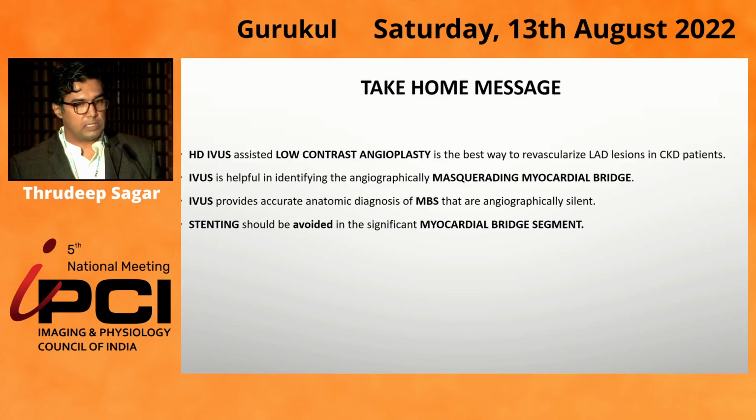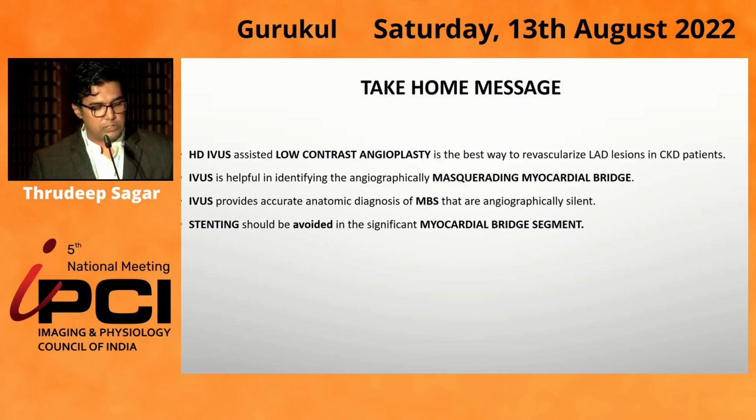My take-home message is that HD IVUS assisted low contrast angioplasty is the best way to revascularize LAD lesions in CKD patients. IVUS is helpful in identifying the angiographically masquerading myocardial bridge. IVUS provides accurate anatomic diagnosis of bridges that are angiographically silent. Stenting should be avoided in a significant myocardial bridge segment.